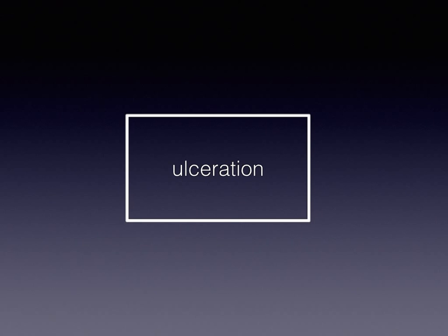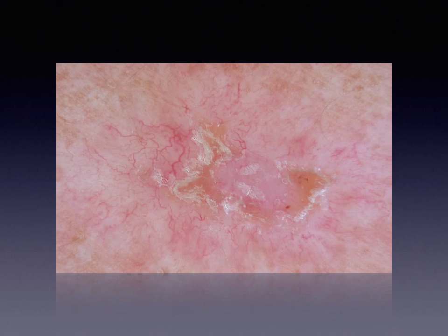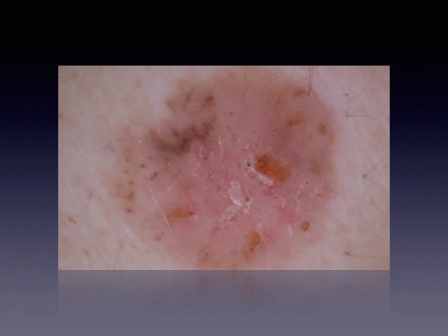Ulceration is also a very common dermoscopic criterion of BCC. It can be seen as a solitary, relatively large ulcerated area of yellow or reddish color, or as more than one smaller ulcerations. Ulceration is not a specific finding, since it can be present in several other tumors, especially squamous cell carcinoma, which is the most common differential diagnosis of BCC.